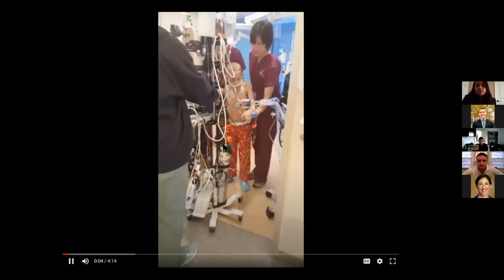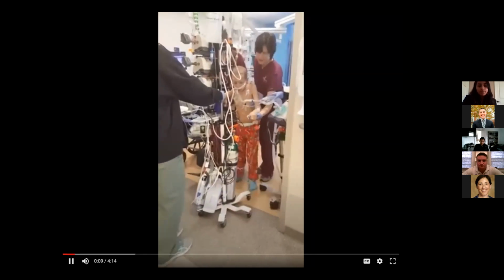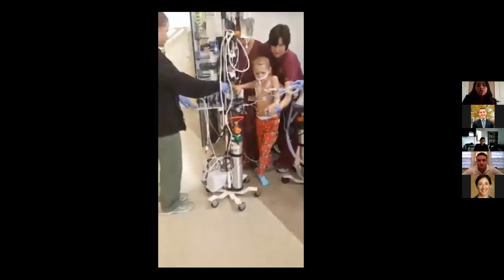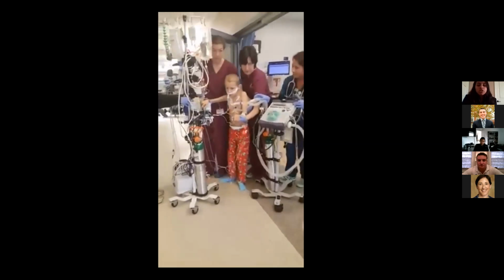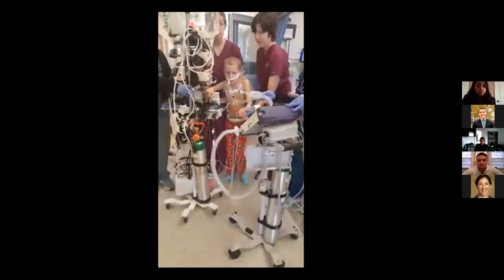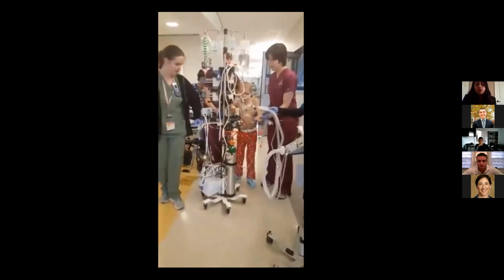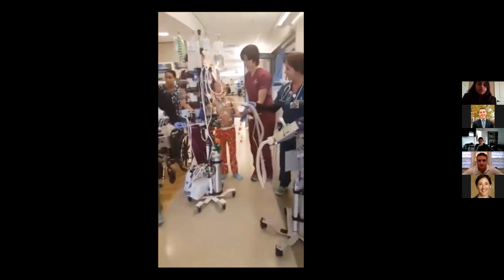You can see from here that there are 5 clinicians that are needed to help the patient walk. I'm going to mute this quickly. Thank you. So 3 of these clinicians are only pushing equipment rather than assisting the patient in the actual procedure. You can also see that there's a dangerous amount of equipment that's been placed on the IV pole in general and at the base of the IV pole. So this is jeopardizing the stability of the equipment that is required for the patient to be held stable, such as oxygen or various fluids. There should not be this much equipment on the IV pole.